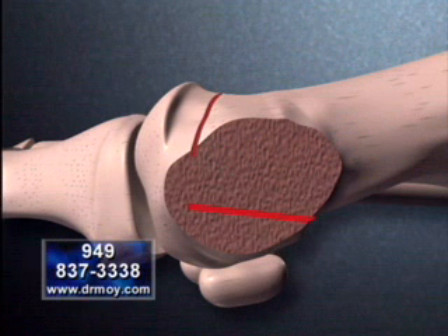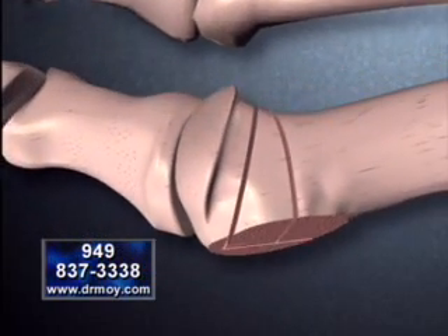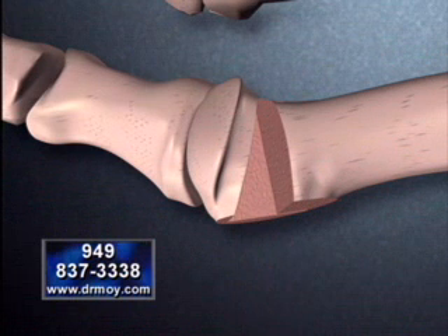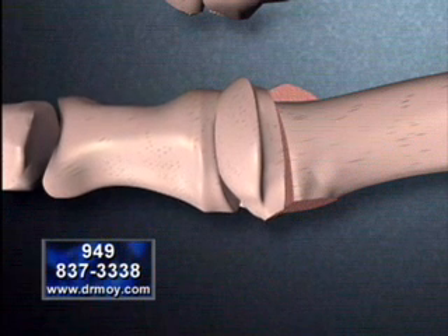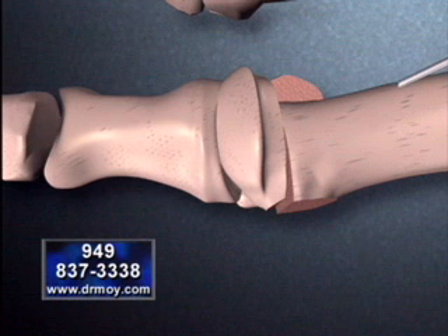The red lines indicate where the long bone will be cut. By viewing the foot from above, we can see how a small triangular shape of bone is removed. This will allow the great toe to be realigned. The entire segment of bone is then repositioned over the two small sesamoid bones.